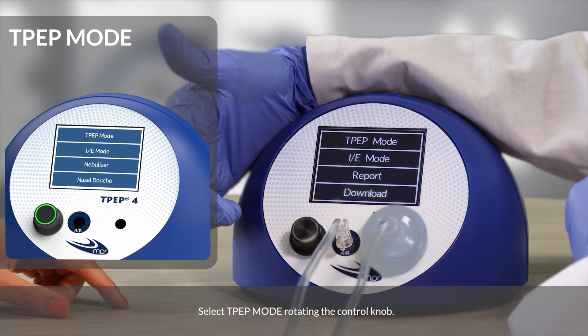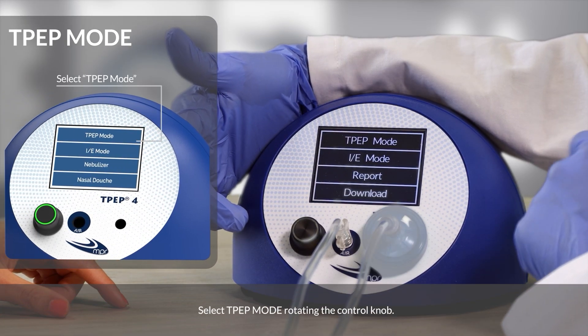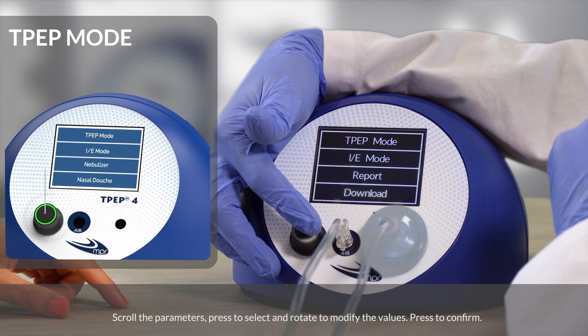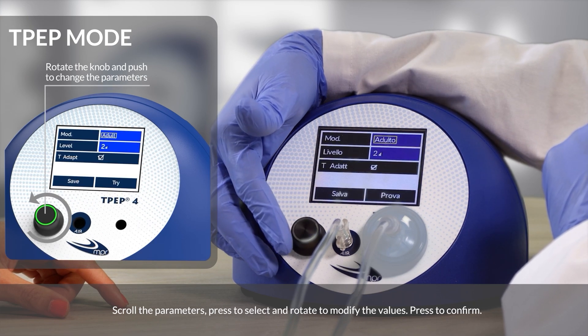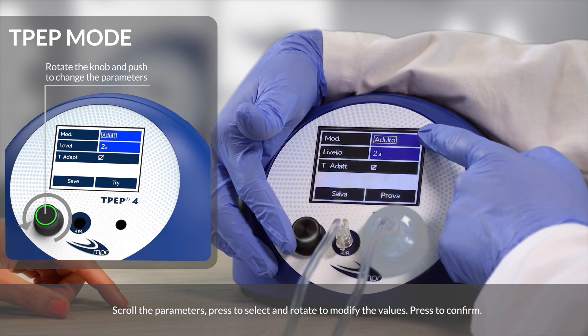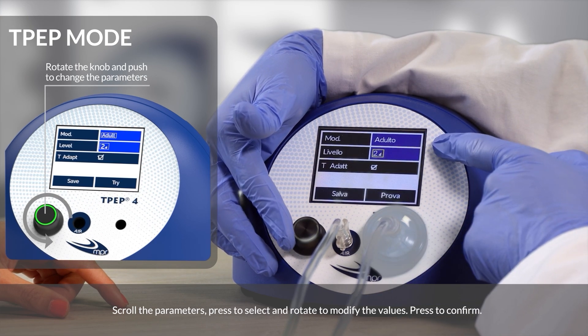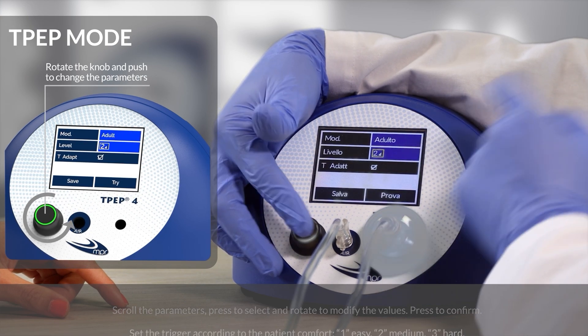TPEP mode. Select TPEP mode by rotating the control knob. Scroll the parameters, press to select and rotate to modify the values. Press to confirm.